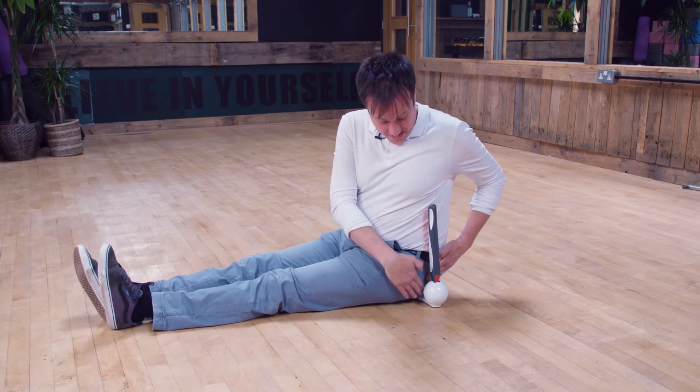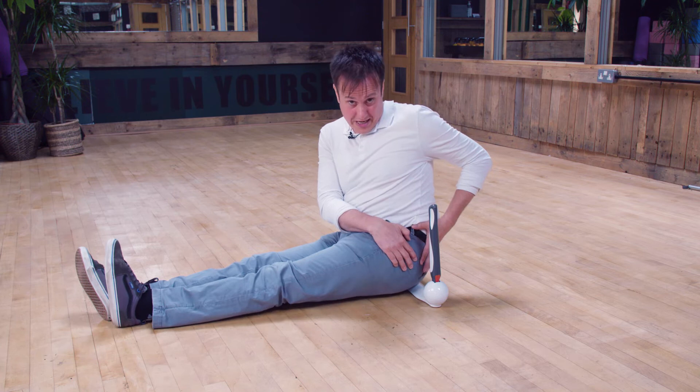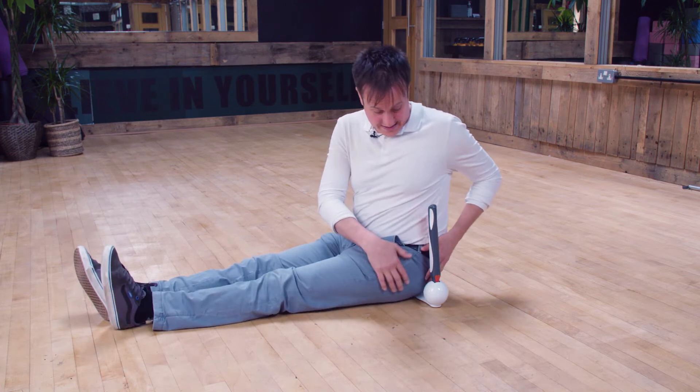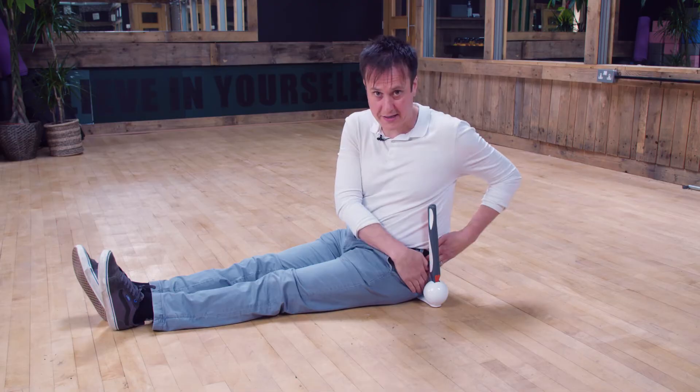Next, make sure that you're a finger's width between your hip and the ball. Don't pull your hip away from the ball when you look at it — tighten up your clothing and put your fingers down in between there. Make sure there's enough space.